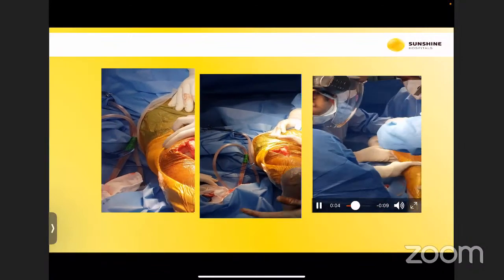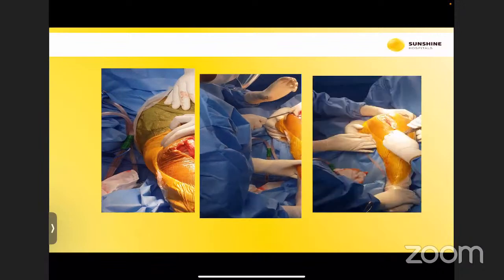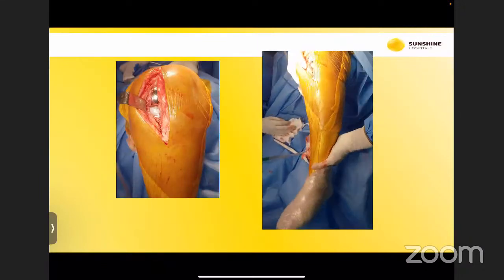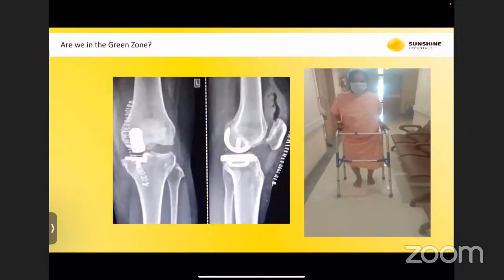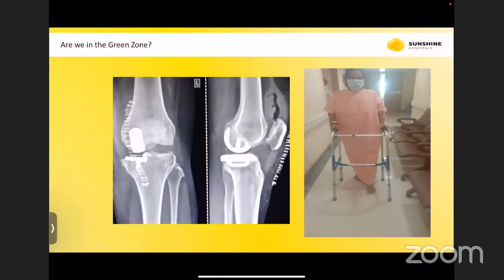Okay. And we found that after upsizing by 2 poly sizes, we got a good stable joint. And we put it in, and we had a nice stable joint without any varus thrust anymore. So we hope for the best. This is the post-op X-ray. It still doesn't look very, very normal, but at least this lady was walking and she hasn't come back yet.